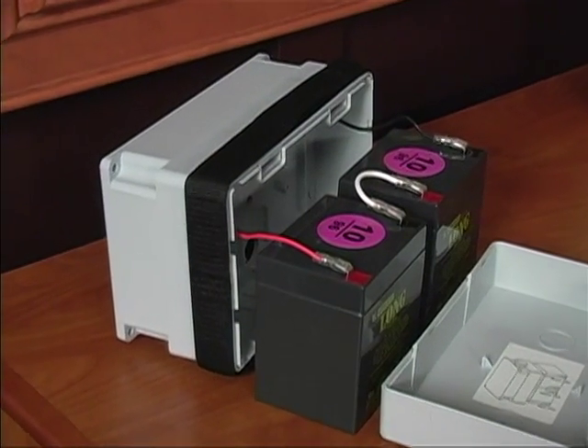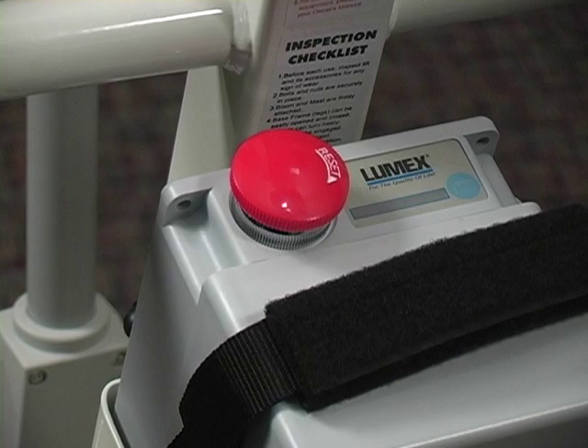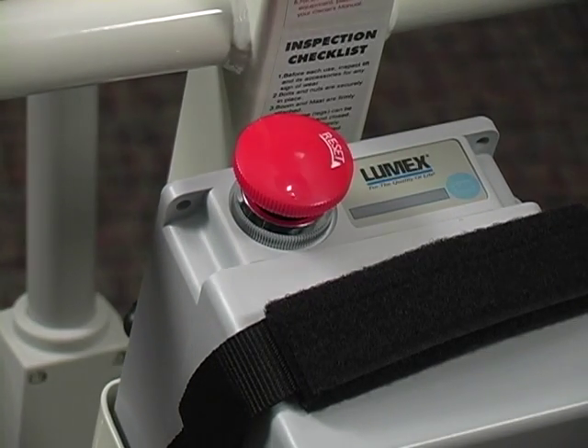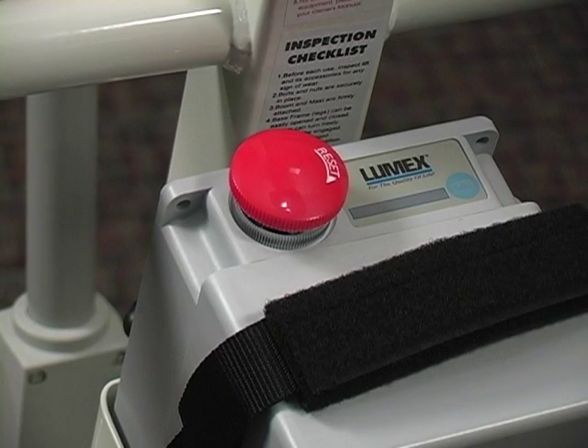Your control box contains two 12-volt batteries and a PC board. There is a reset button on top. When the button is down, the lift will not operate or charge. By turning it clockwise, it will pop up. When the lift is not in use, the button should be pushed down; otherwise, the battery will slowly drain.